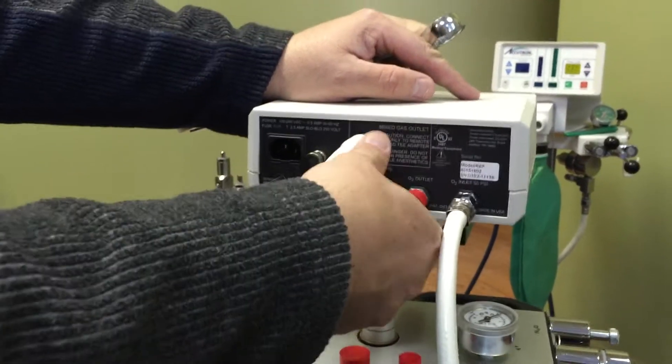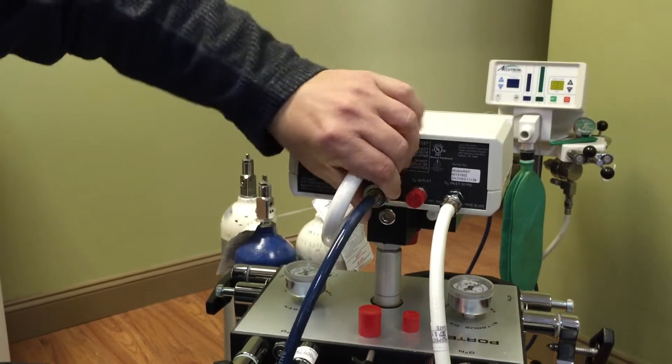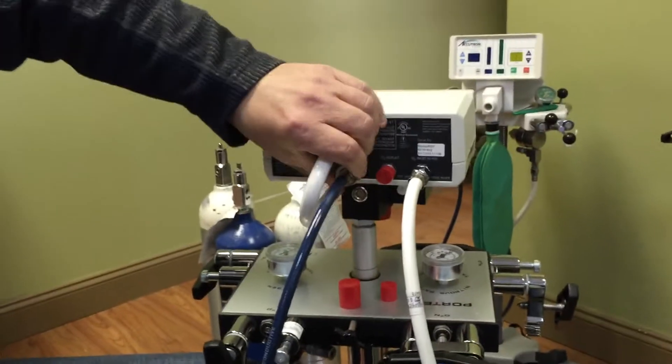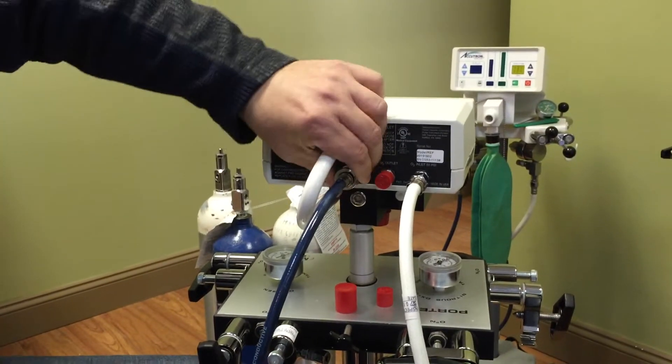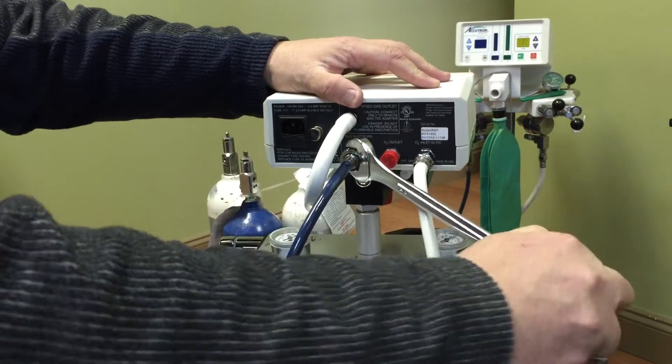And again, this one just screws on. You can hand screw it on there. Once she's tight, just snug it up with a little key. It's going to be a 7-8 key. Go on there, snug it up. That's it.